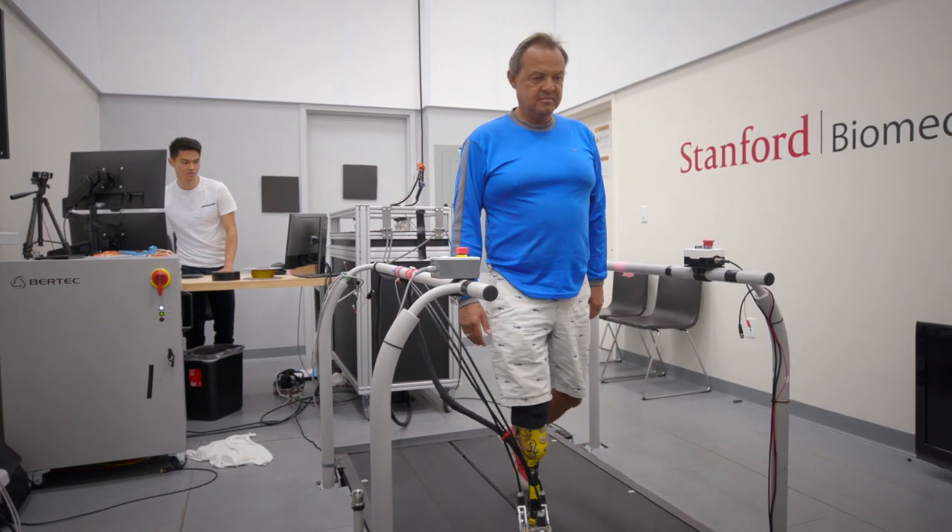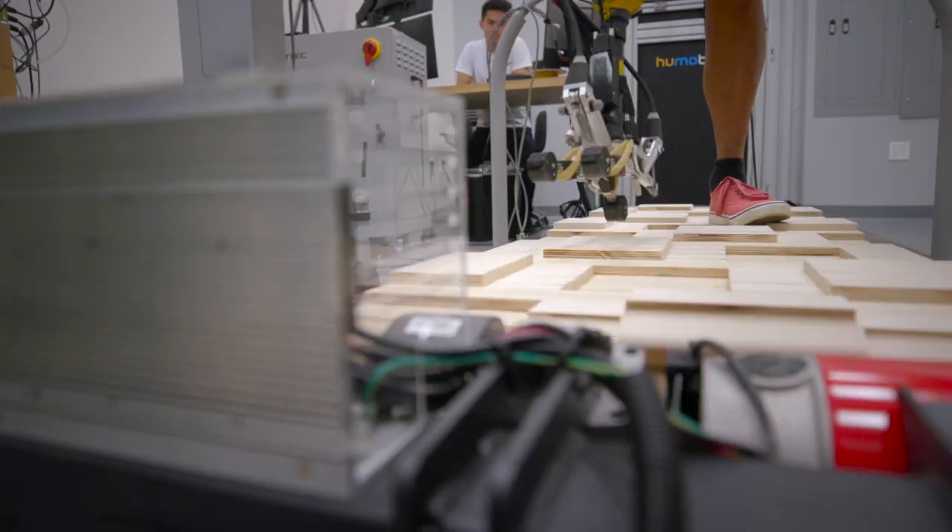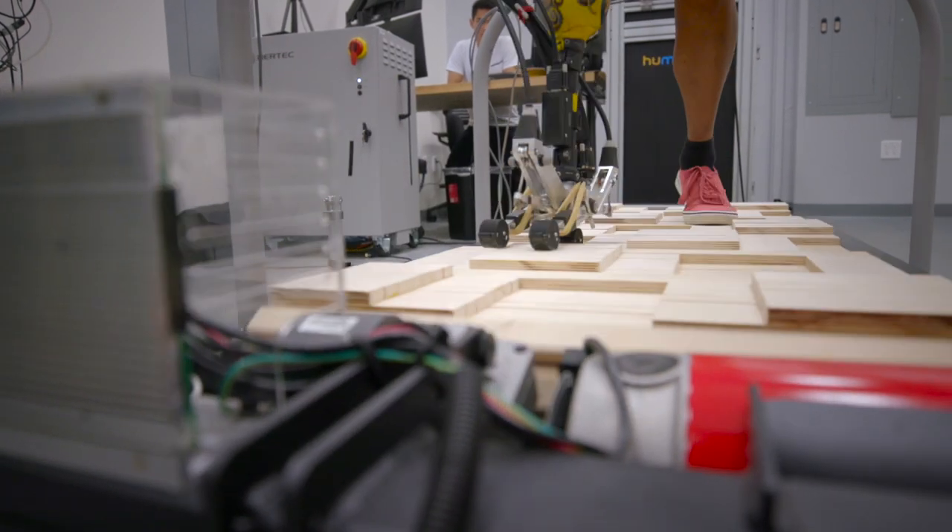There are about a million people in the United States who have amputation, and about 500,000 people need lower limb prosthetic devices. The majority of the devices on the commercial market are just shaped carbon fiber, and I think we can do a lot better, especially if you look at the technologies that are out in other fields of robotics.